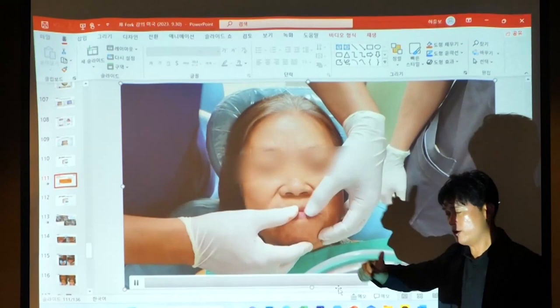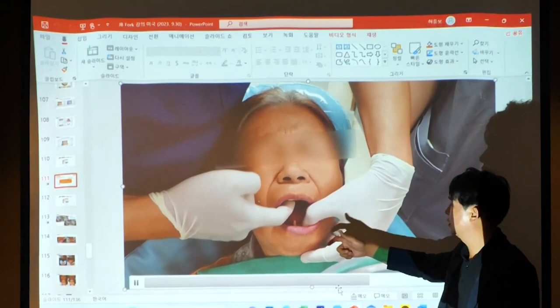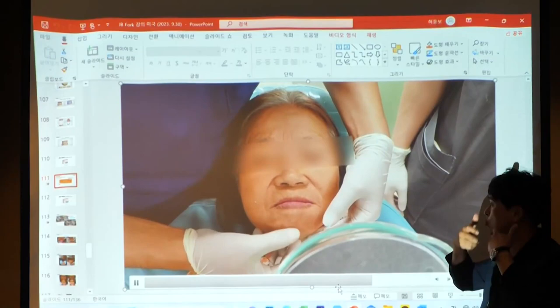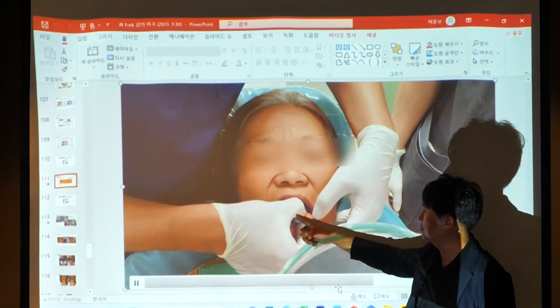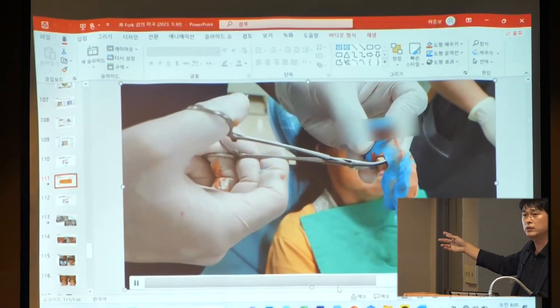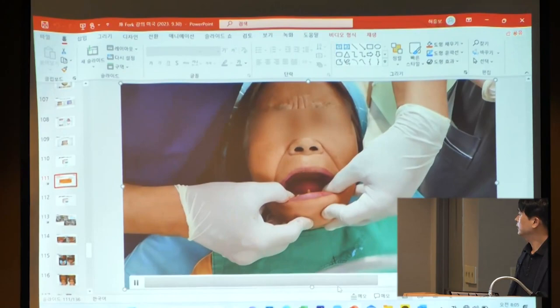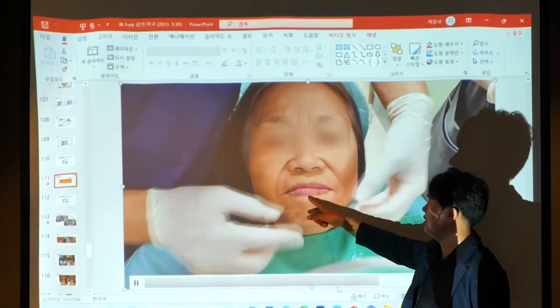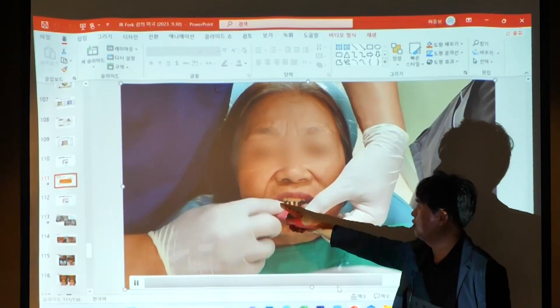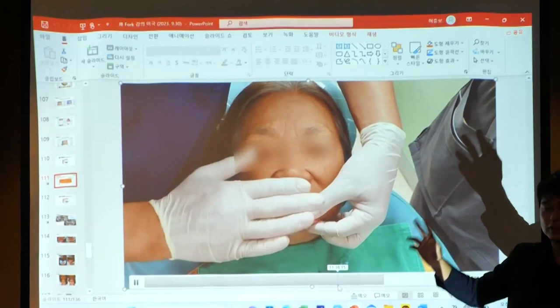So at that time, I repeated the CR, positioned the CR, and then at that time, it is necessary to remove these six teeth, right? So it's a very simple method by manual manipulation. And then I reduce the tension, assessing the tension with the patient. And then I turned the pin and reduced about 2 millimeters of vertical height. After the biting, like this, she has a class 3 tendency. After that, I checked the swallowing and speaking as well. So everything I can check. That means I will reduce these teeth for your beauty. And then she agreed.